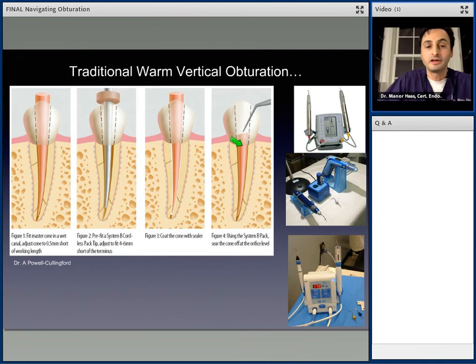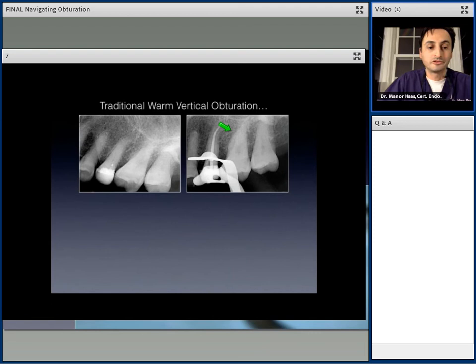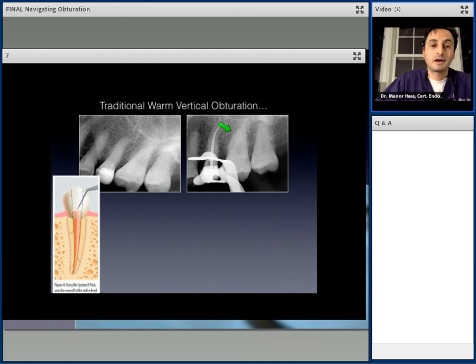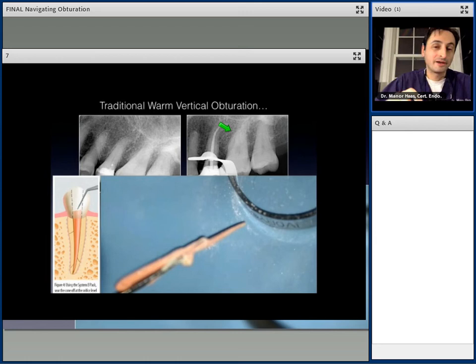However, even though we've just started, this is where time after time I find people having issues. And I'll take you to this little video over here, where you see in this radiograph the gutta-percha that I've been fitting in here. As you'll see in a moment in this video, I've got my master cone, hopefully with tug back. I'm trying to sear it off with a hot instrument at the CEJ. And what happens very often to many people, and I see it happening to my students, as we try and sear it off, the whole cone comes out. We've just started this technique. We've barely even started any of the important steps, and already this thing has come out.